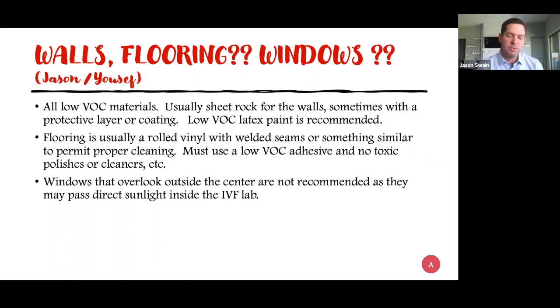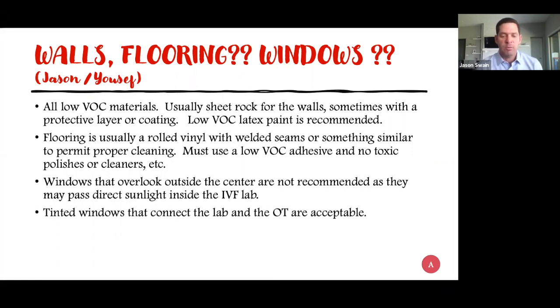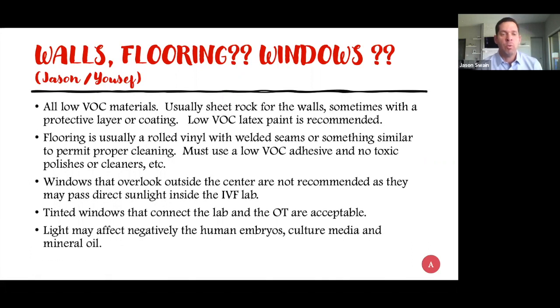And in terms of windows, we try to minimize windows. We don't say we can't have them at all. We actually get more concerned about the impact of temperature and the environmental regulation. A few windows are probably good for embryologists' peace of mind. You can put shades, you can put UV filters. So you certainly don't want to have a corner suite with all windows, but a few I don't think are at the end of the world.